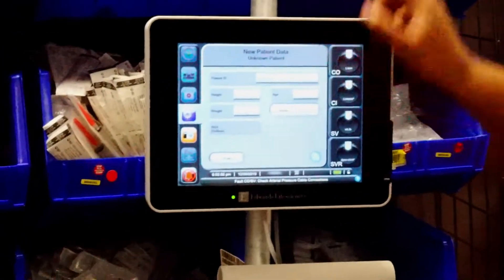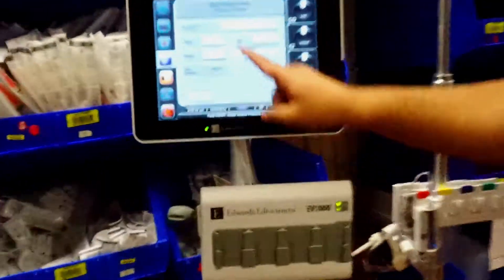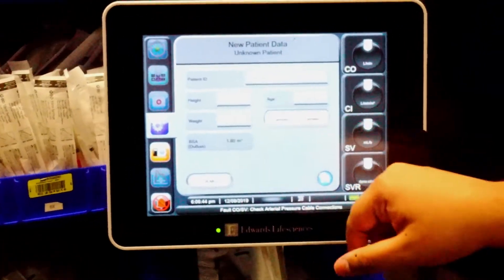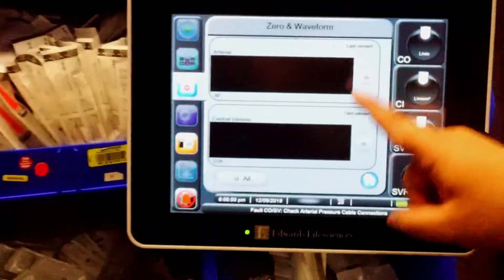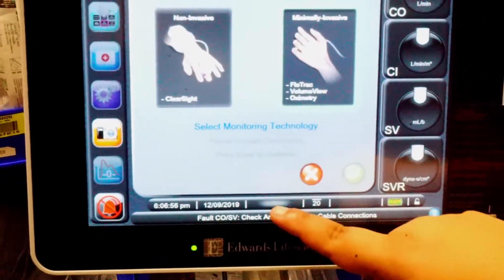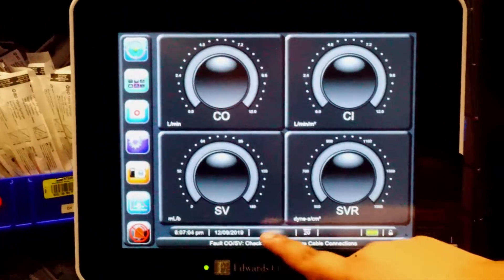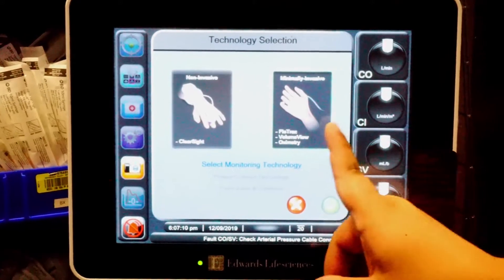Go ahead and put in your patient's information. Note that you can switch from inches to centimeters and from pounds to kilograms if needed. Press the home button, and right now it says arterial and central venous. We're going to change from flow track to clear sight — clear sight is non-invasive. Press the gray section to switch from flow track to clear sight.